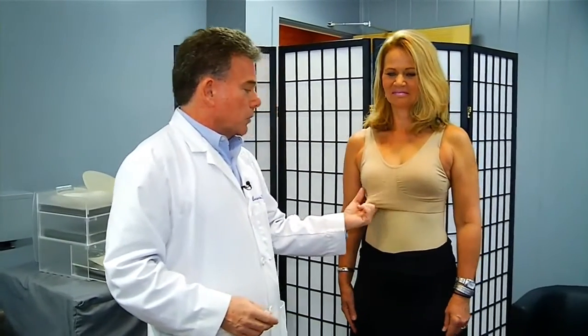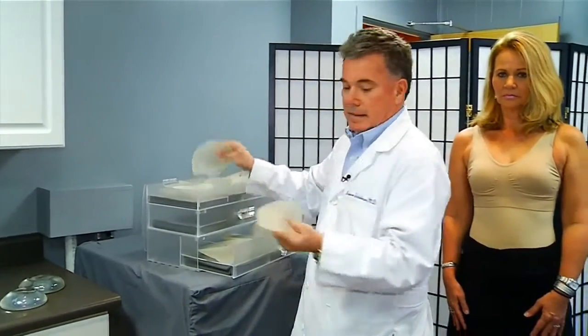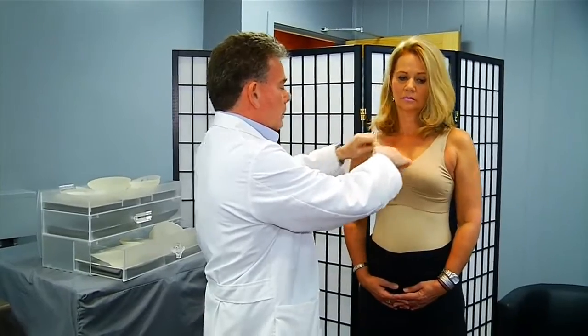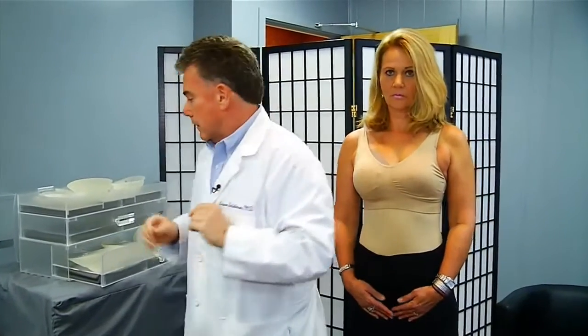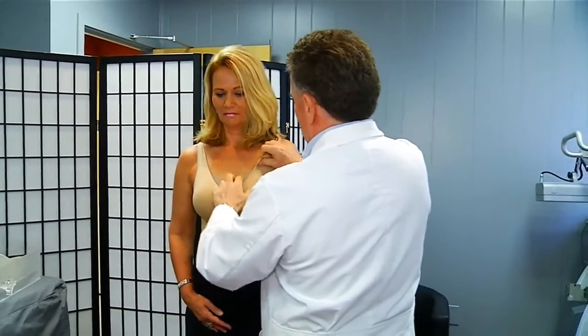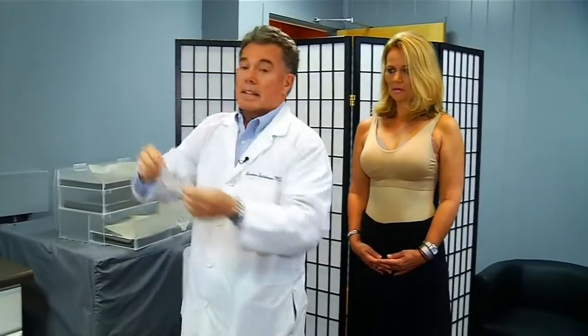We have Lynn here with a beautiful figure, and she has a sports bra. So what we do — we have a sports bra, and we have different sizes. For instance, this is a 450 mL size. The shape is just the way these sizes are; they have this shape. So you come in here and put the implant here, adjust it a little bit, then go to the other side and put the sizer there. Then the patient will look in the mirror and see how it is. If she likes it, she likes it. If she wants a little bit bigger, we have these little cups here — these are 75.